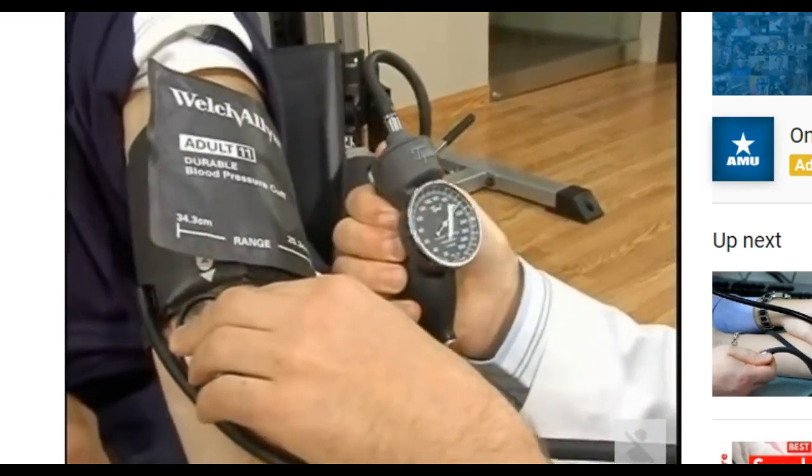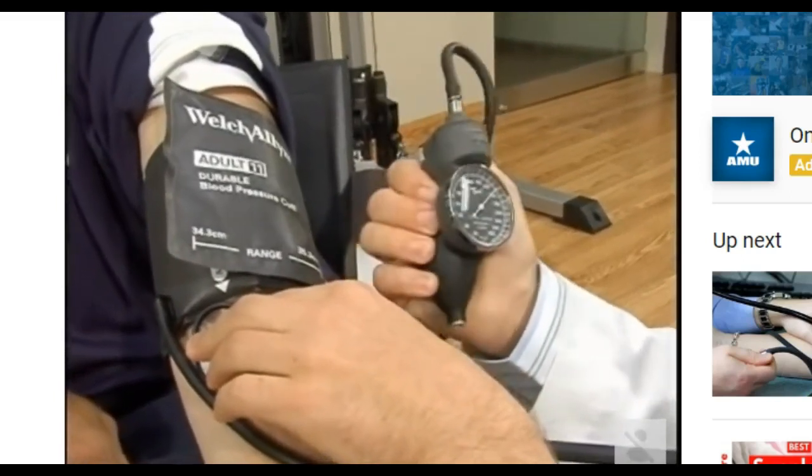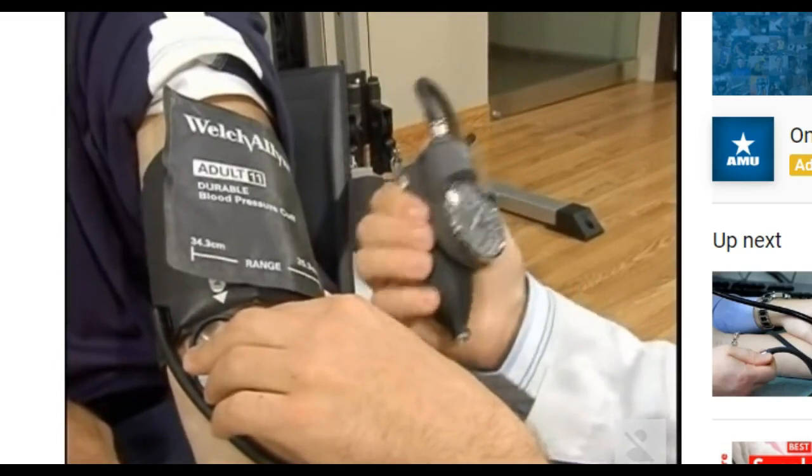So the cuff should be about 80% of the circumference of your arm. It doesn't have to be exact. Around 80%.